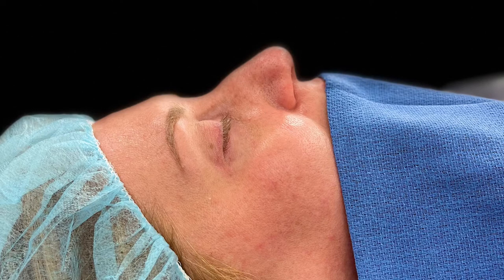This video will be demonstrating a high septal strip preservation rhinoplasty technique. You can see the patient here on the operating room table before we get started. She's got a dorsal convexity which is what's bothering her the most. I chose to do an open technique here. The high septal strip will be demonstrated, and we'll use the piezoelectric device in order to shape the bony cap and reduce the bony portion of the convexity.